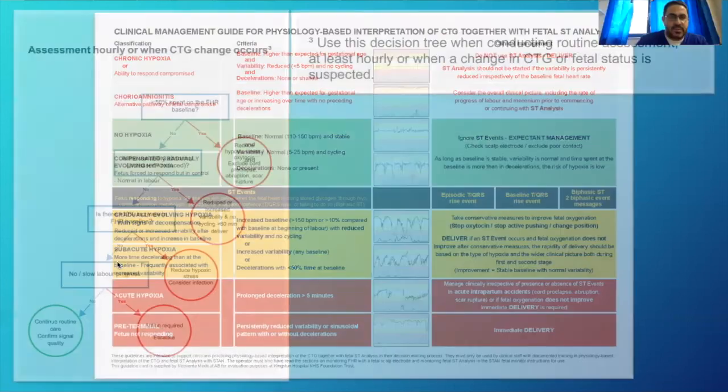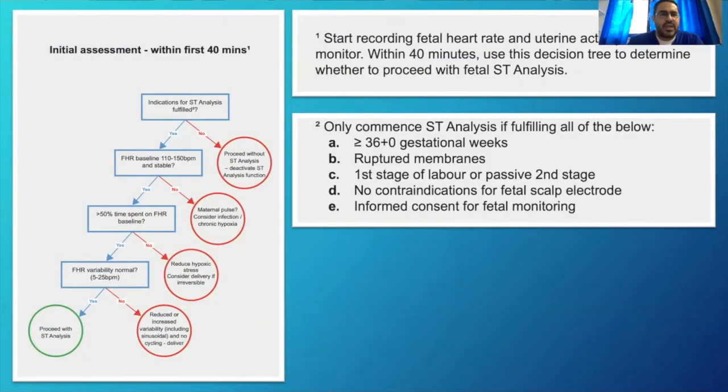So you've also seen on the back of the information card, there's also the fast and frugal trees. This is basically the assessment tool when we're starting to use STAN.